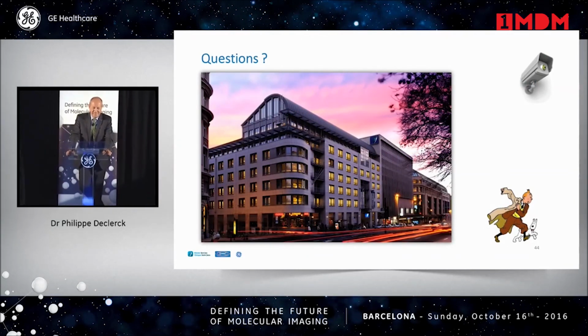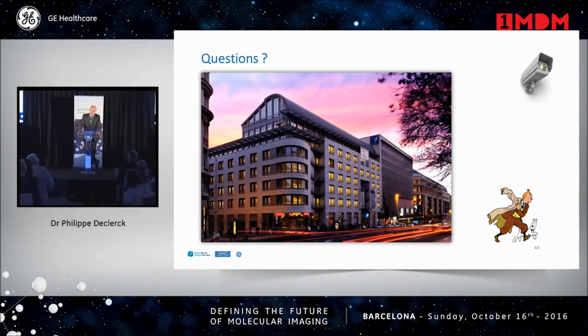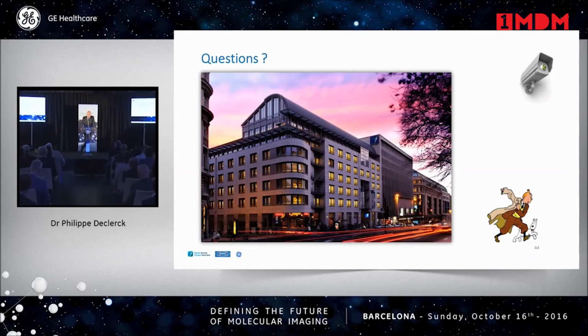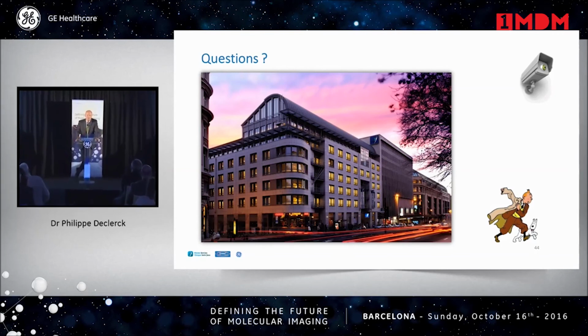So, Professor de Klerk, between time and dose, how do you make the decision? Well, that's a good question. At this moment, we are still validating the system, and we focus on time reduction to do faster scans and to have a high patient turnover with our system.